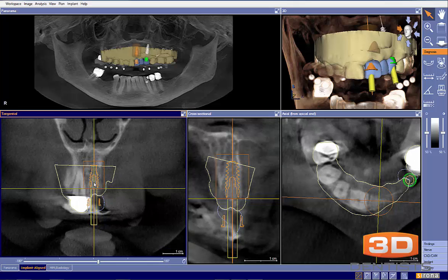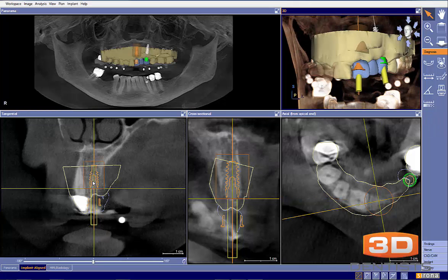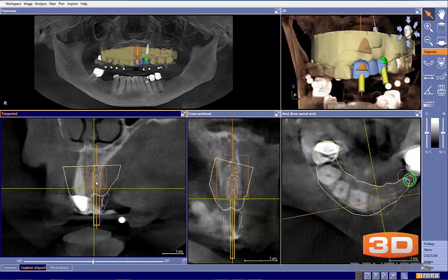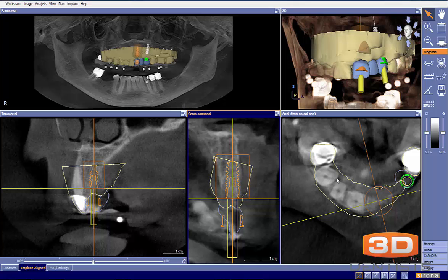As I tilt this implant, now we can see that we're pretty straight across, just like so. Okay. Then we go ahead and adjust the position here to get it better centered in the tooth, because as we can see here we're in the mesial, so we'll just move it to the distal a little bit, about the center of the tooth there. And now we can start working on our placement itself.